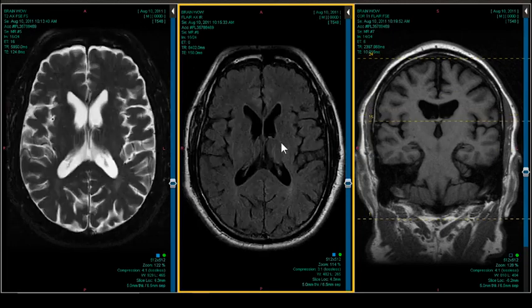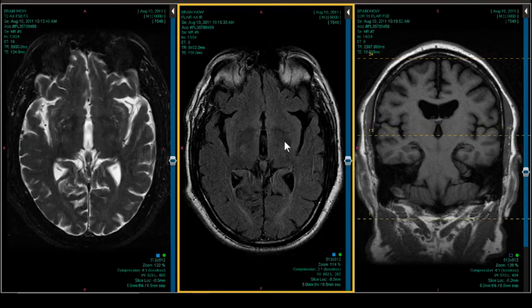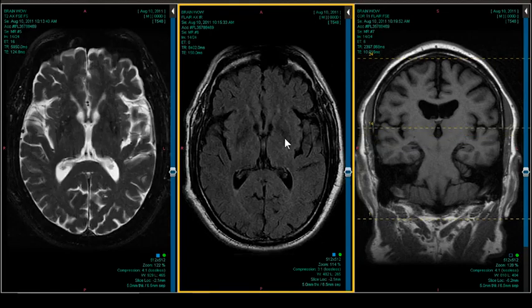Now, as far as, is there any differential? Well, with the information that we have, that is family history, probably there's not. But if all you have is the image, how about something like Wilson's? Because that will affect the basal ganglia. Right. Unlikely, but that might be another thing you could think about in inquiring about the history. And maybe a toxic metabolic cause could also affect it. Sure, fair enough. And in Wilson's, they do get chorea.